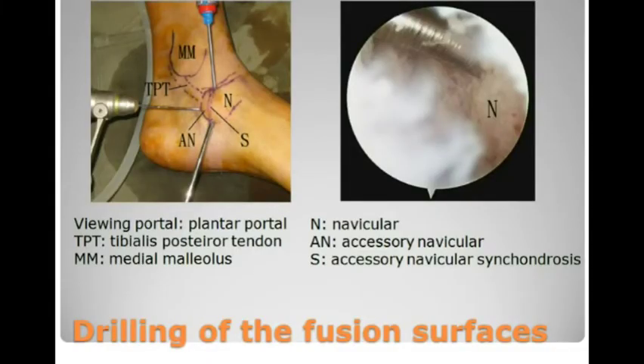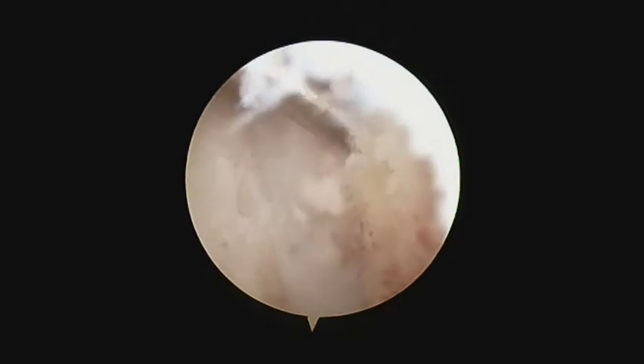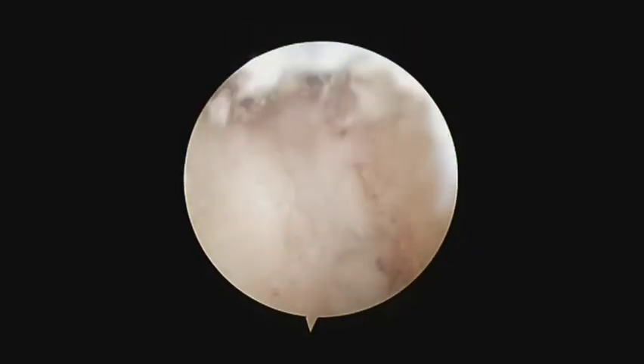After clearance of the bone surfaces, the fusion surfaces are prepared by microfracture by means of arthroscopic or percutaneous drilling of the synchondrosis by means of a K-wire.